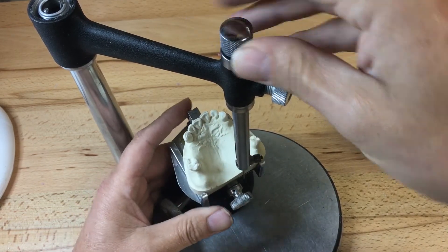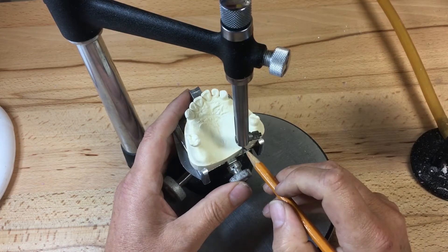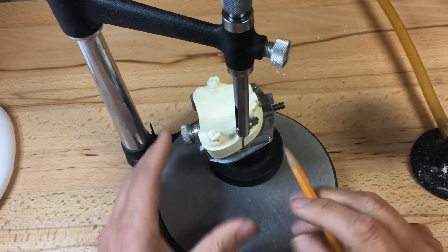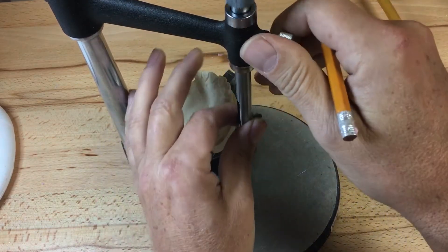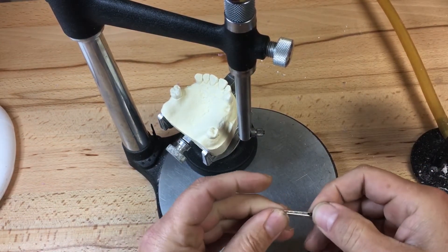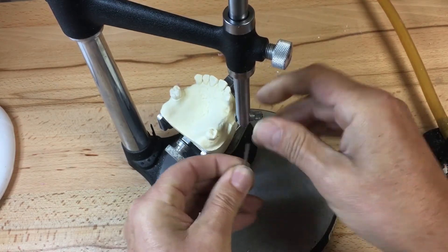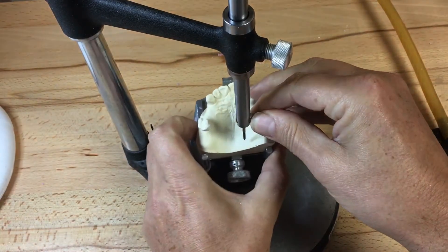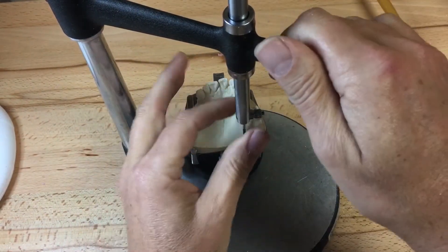Once I'm satisfied with my path of insertion, I can tripod the model in several ways. I can use the analyzing rod on the posterior base of the model, outlining the analyzing rod carefully with a sharp graphite pencil on an x-axis and a y-axis of the model. For provincial examinations they probably want you to put three widely spaced points on the palatal surface of the model. I'm going to put the graphite pencil into the surveyor, take out the analyzing rod, and start tripodding at three widely spaced points.